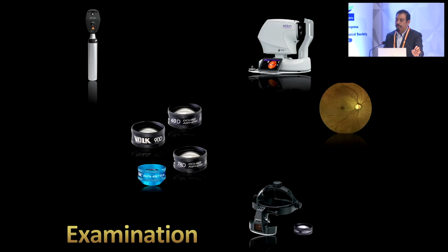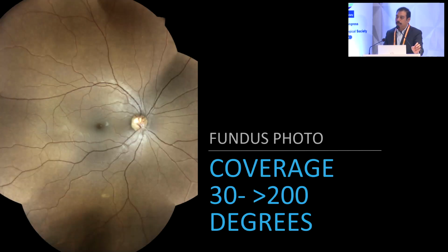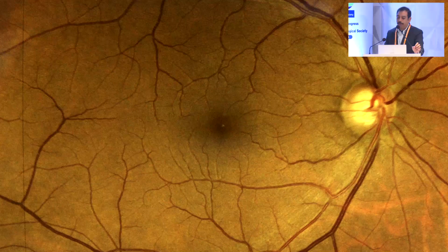So we have multiple ways how we can do the examination of the fundus, but I prefer only these two, like slit lamp as well as the fundus photography. But I want you to really appreciate how big the fundus photography is going to be in comparison to what we see in our, even if it is dilated fundus examination. So this is the area of interest for us.